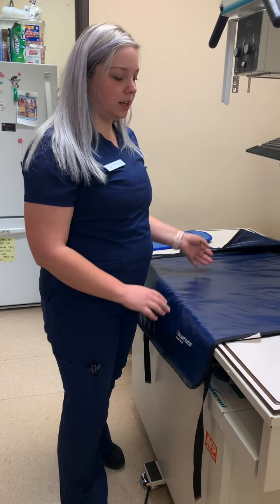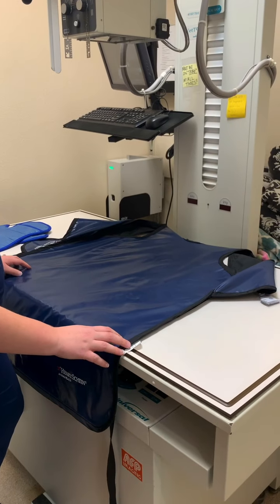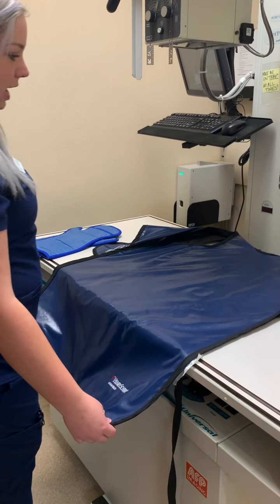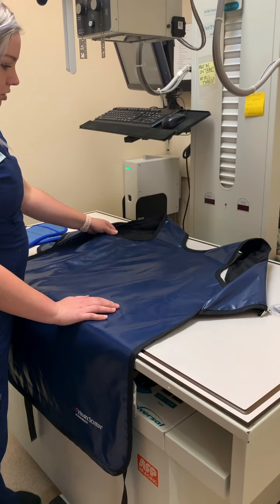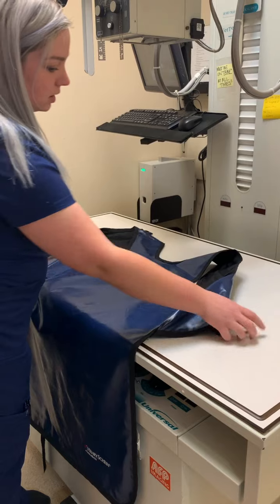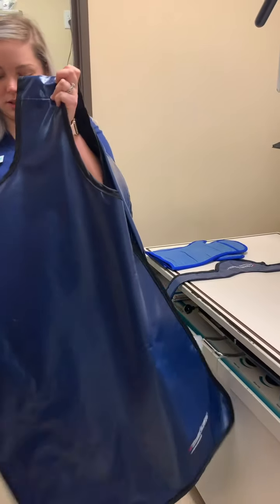Now we're going to take a look at our PPE. You want to visually inspect for any scratches, holes, any tears or anything like that before every radiograph taken, just to make sure that you are fully protected. So we have our lead gown here, and then we put it on like this.